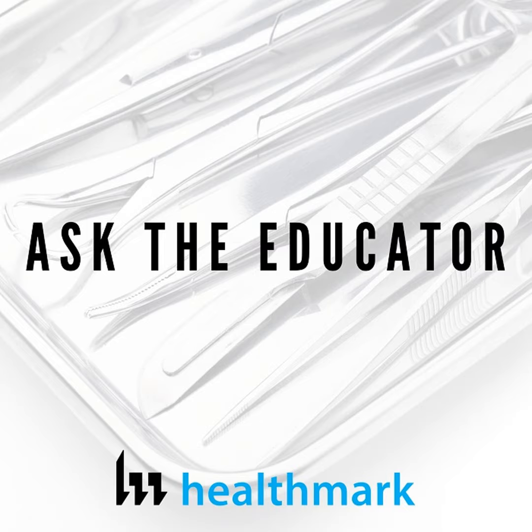And then we looked at other systems at some hospitals. The SPD director at one hospital just had an Excel sheet, and she relied on word of mouth, or people reported it. In one example, they had two hospitals in this community system, and she was recording from both hospitals an average of about 10 events per month by her system. And again, it was just an Excel sheet, literally a list of, it was a hole in a wrap, or a wrap had a hole in it, or the wrap was torn, so you couldn't standardize it to do any kind of sorting to say, okay, how many times did we have an event that was related to a hole in a wrap, right?